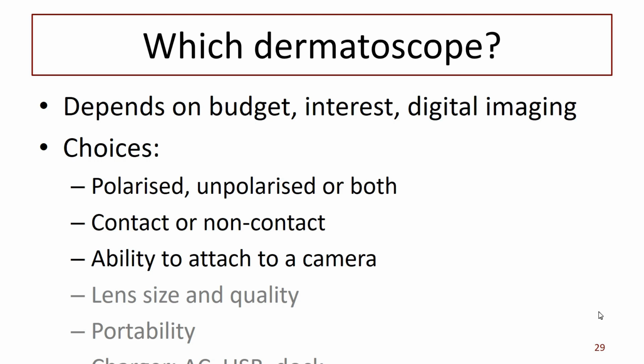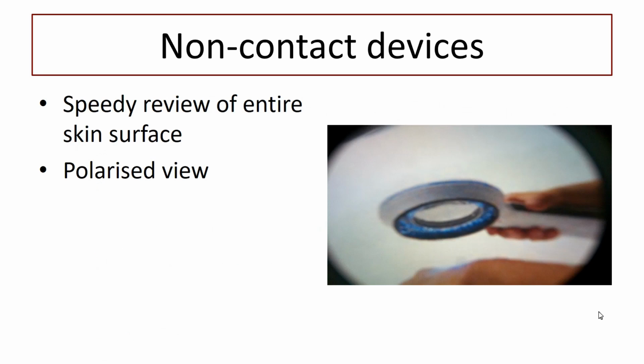So, for example, in my situation, I'm going from room to room, I rush up to the wards, I need something that will sit in my pocket or clip onto my belt. And how you charge it is a personal thing, but preferably USB these days, because we've all got a computer in front of us and we don't want to rush around looking for charging devices.